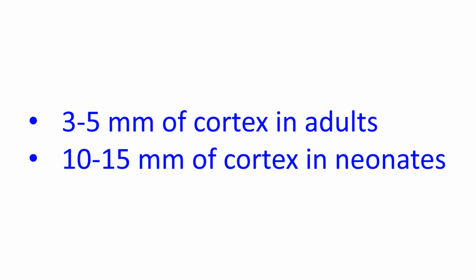Cerebral oximetry, or measurement of oxygenation of the brain, has been studied most widely in the field of cardiac surgery. This is because these operations can lead to significant neurologic complications and associated morbidity and mortality. NIRS can also monitor oxygenation in muscles. NIRS monitoring in muscles has found application in the field of sports science.